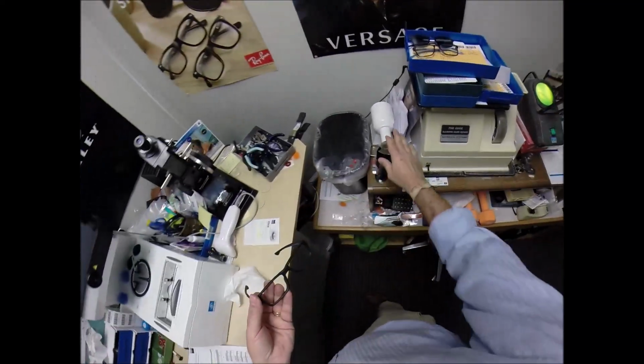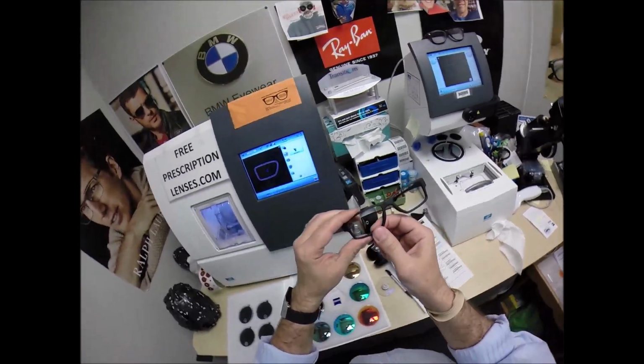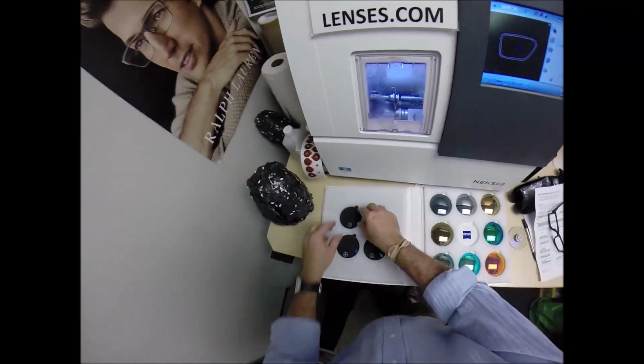A lot of optical shops like to use heat. That would make the plastic more pliable. But the lens, if it were too large, would cause force against your frame, causing your frame to stretch or roll, giving you an ugly cosmetic look, as well as shortening the life of your frame.